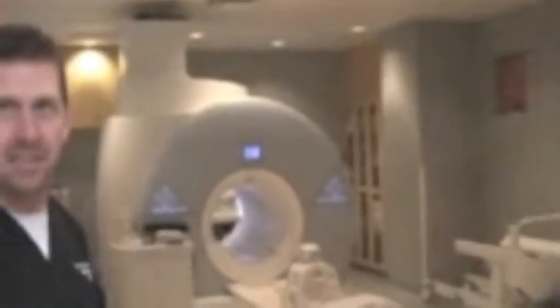Or the actual structure around it. If you look over at the far end, you see a big copper door on the wall. Our whole area needs to be lined with shielding structure around it. Probably another couple million by the time you count the copper and all the work and all the metals that have to be put in there. Probably, if the room was already here, about $4 million to get that thing up and going, and bring the power into it.